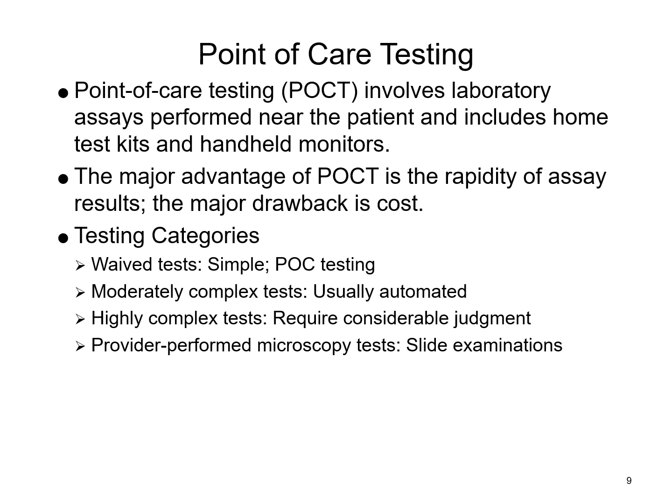Examples of this will be serum protein electrophoresis, doing blood types and crossmatches. Some of your micro testing will fall into this category, like plate reading. And then you also have provider-performed microscopy, when the physician or nurse practitioner, someone who's had proper training, will review slides that are collected at bedside. So this is something like wet mounts or body fluids, things like that.